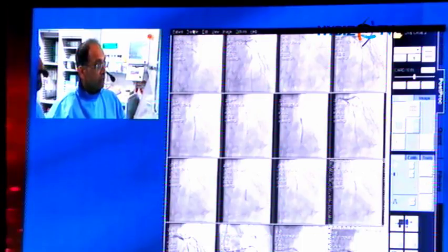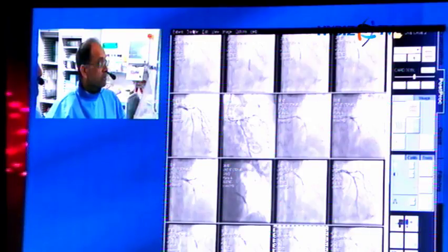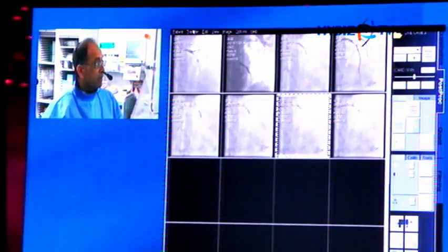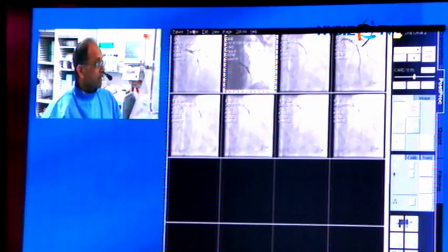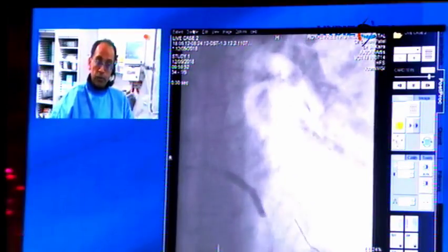Go further down, please. Thank you. And down. And then the second last image, please. No, sorry, page view again. Apologies. Go to that one, please. And that's the stent deployment. Next shot. So on this occasion, again, with referencing.